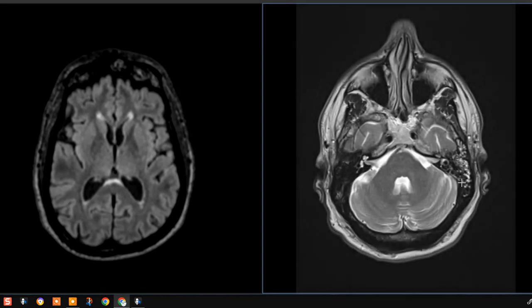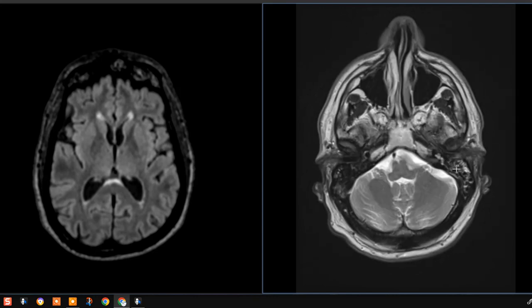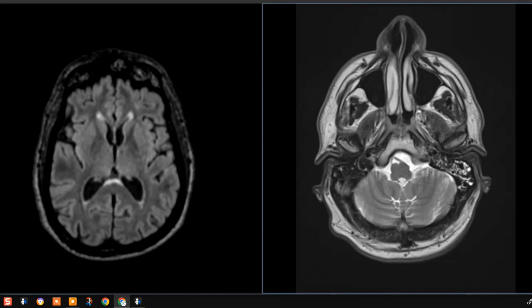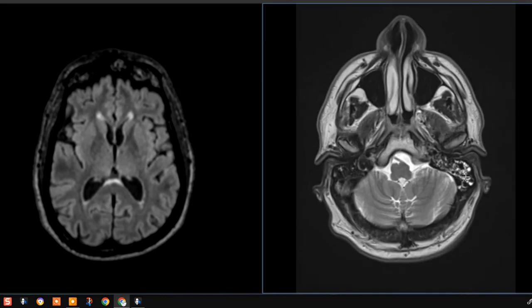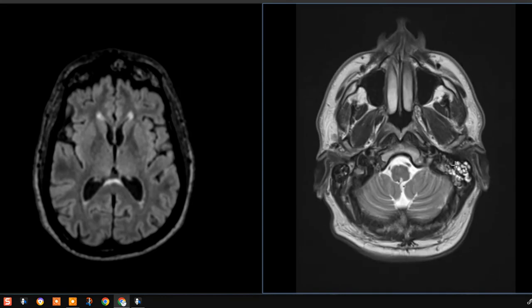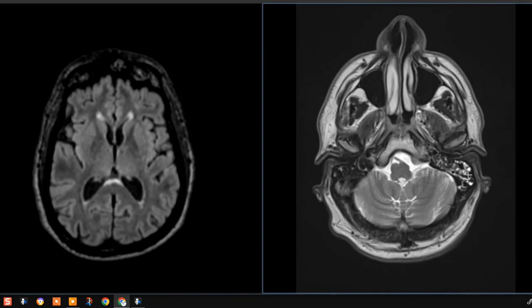So in this patient they were symptomatic, so we call this left mastoiditis, which does correlate with this history of recurrent ear infections and pain. There's some involvement in the lower aspect of the left mastoid portion of the temporal bone — those little bright areas of fluid or inflammation.